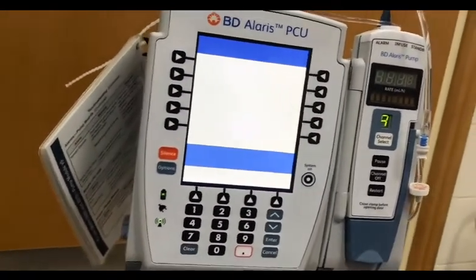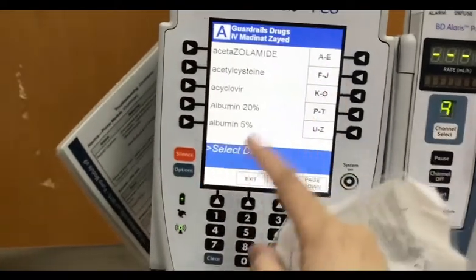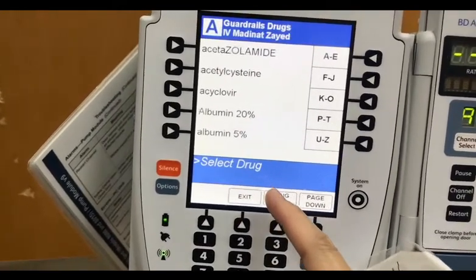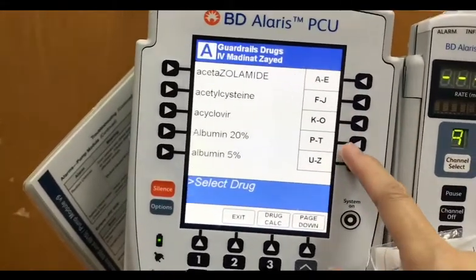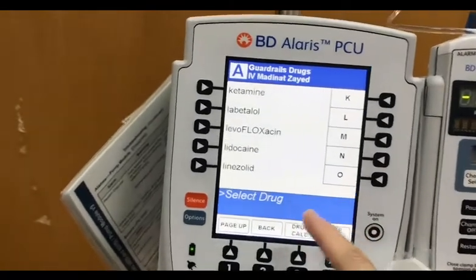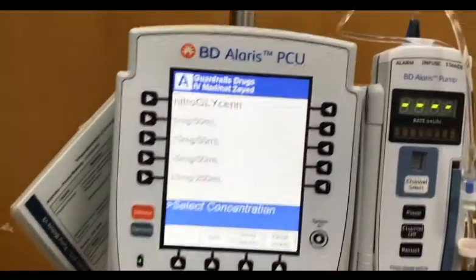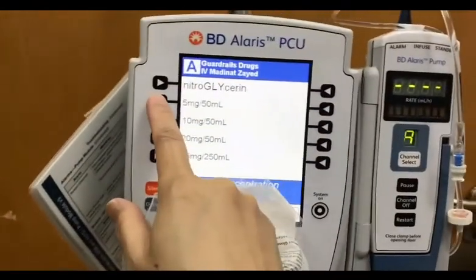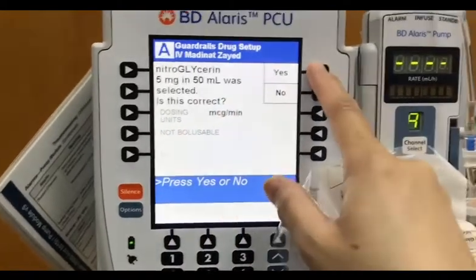If you will do the guardrails, go to channel select again. Guardrails drugs. For example, if you infuse, let's say, nitroglycerin, just go to where the letter N is. So this one, the N, nitroglycerin. I want to infuse the nitroglycerin. So I want to start the 5 mg/50 ml. So just press this one. 5 mg/50 ml. Is this correct? You will confirm yes, that is correct.